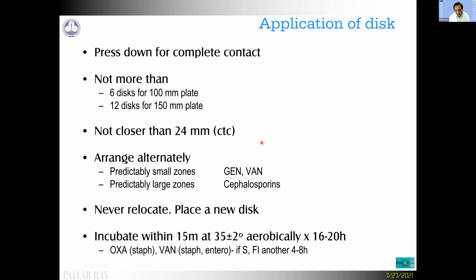Sometimes the disc falls at an unintended place. If that happens, never try to relocate the disc by picking it up and putting it at the right place. You pick it up and throw it away and take a new disc. Incubate within 15 minutes after you have placed the discs, at 35 plus or minus 2 degrees, aerobically, for 16 to 20 hours, except for certain situations where we incubate for at least 24 hours.